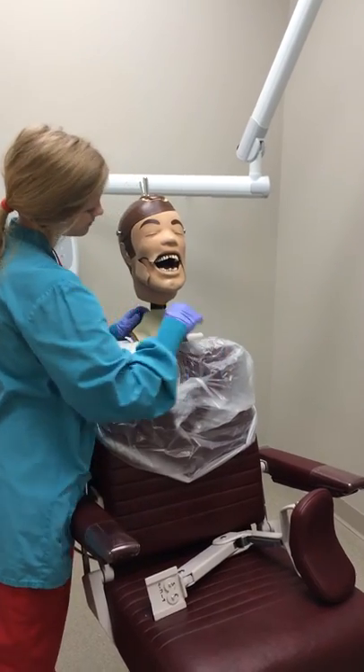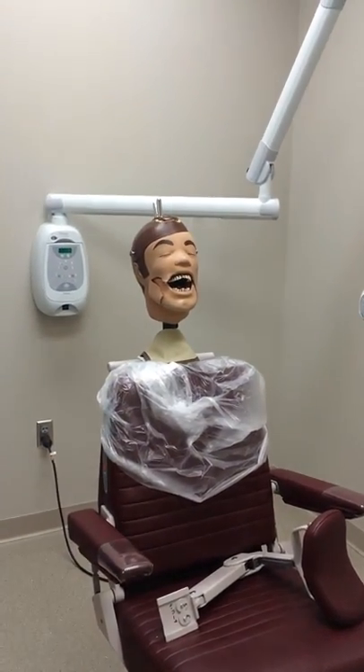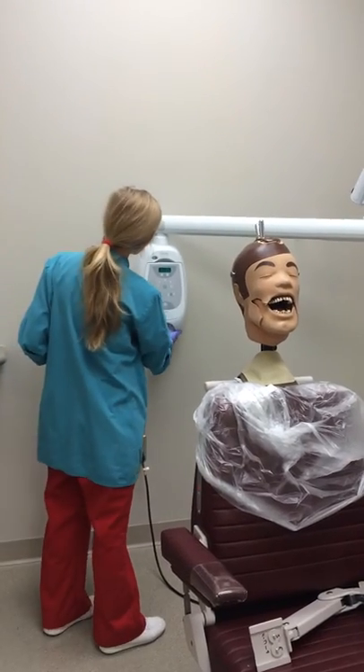Occlusal radiographs use a bisecting angle technique. This involves using the angle found between the long axis of the tooth and the long axis of the film sensor. First, turn on the power switch and change the setting to anterior.